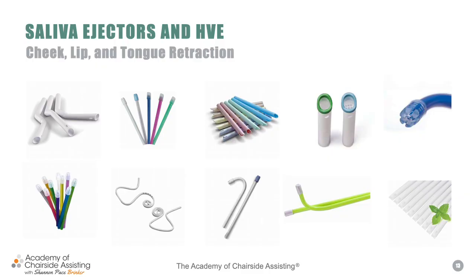Now, let's get to it. Let's talk about saliva ejectors and HVEs, and you'll really be able to identify these very, very easily. The saliva ejector is very small and comes in different colors, as you'll see here. The HVE is always going to go on the larger suction, and then, like I said, the saliva ejector is always going to be on the smaller end. And we're going to start today by talking about the saliva ejector.